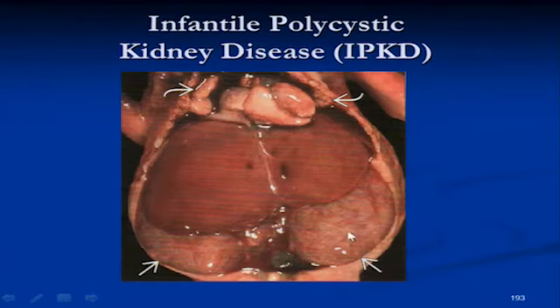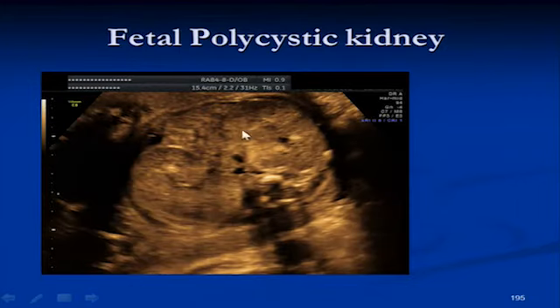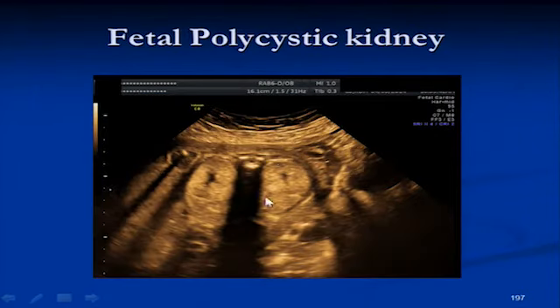This is just filling here. The kidneys usually fill the abdominal cavity, leaving very small space for the other structures. This is our baby here. So this is all kidneys, filling the abdomen. Here again, this here and here. Now you appreciate how wide those kidneys are. See that? They're almost as wide as the vertebrae here.